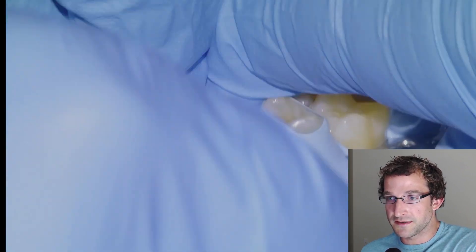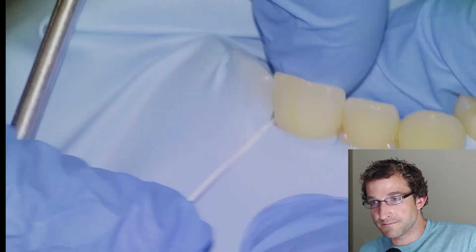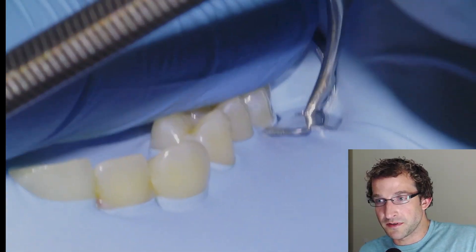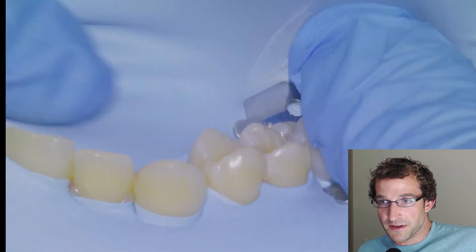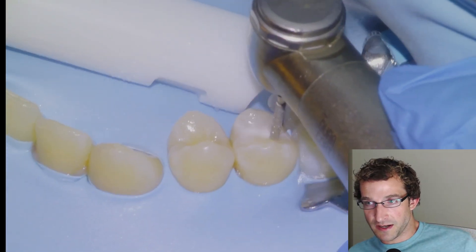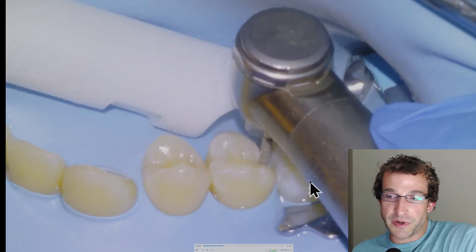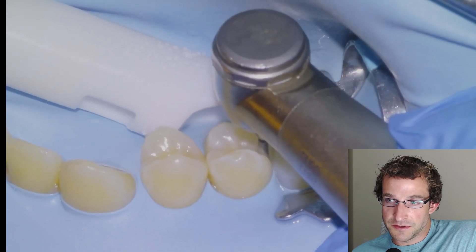We'll tuck the dam under the wings and then floss the rest of it through the contacts to isolate the quadrant. We'll adjust the clamp — the rubber dam is kind of tugging on it — and then snip the septum so it doesn't get in the way. A little bit left in the contact there, but we'll get that out, and then we'll start the prep.